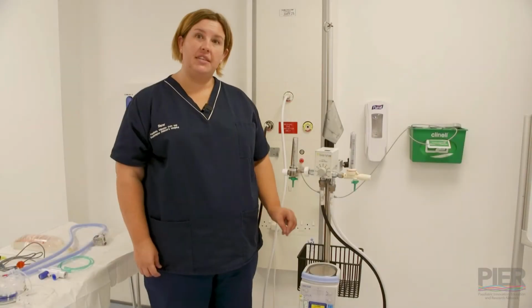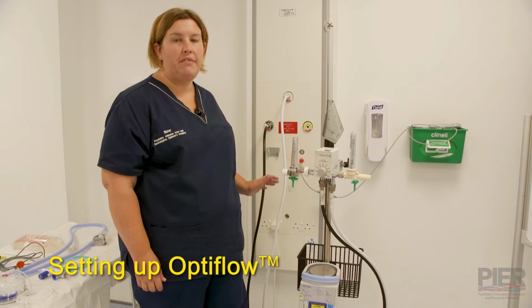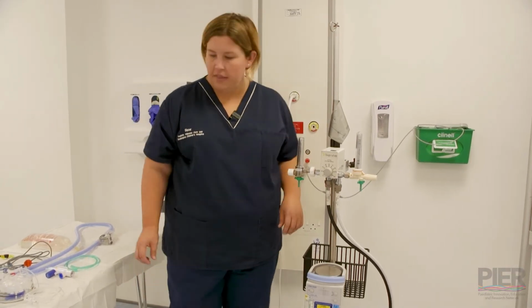This is going to go through setting up an Optiflow for you. So you need to make sure that you've got both piped oxygen and air to be able to run an Optiflow. So get those plugged in.